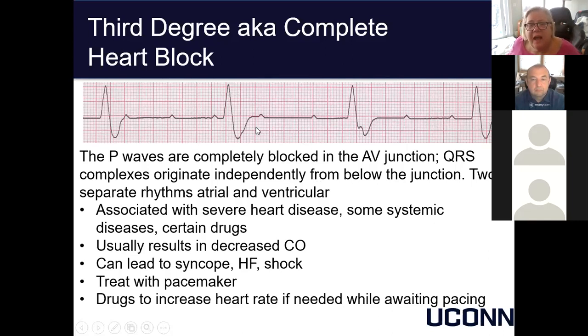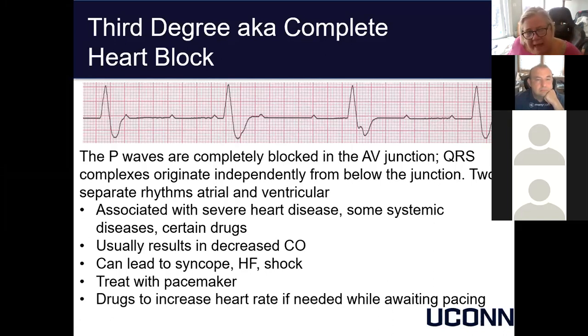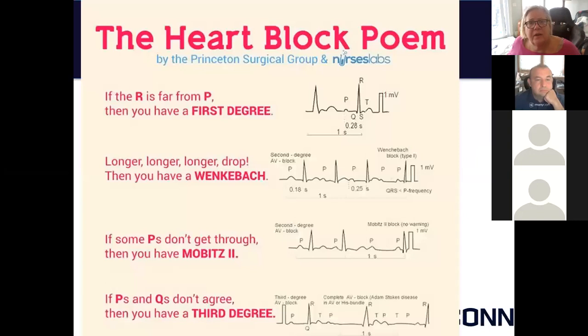Significant decreased cardiac output. This patient needs a pacemaker. Emergently, they'll apply an external pacemaker nowadays. They might thread a temporary pacemaker in at the bedside, but this patient needs a pacemaker. You don't have an event like this and go home without a pacemaker. Besides that, our ventricular response is way too slow. Again, this patient is probably lightheaded, dizzy, with altered level of consciousness and bad cardiac output. Not a good scenario.